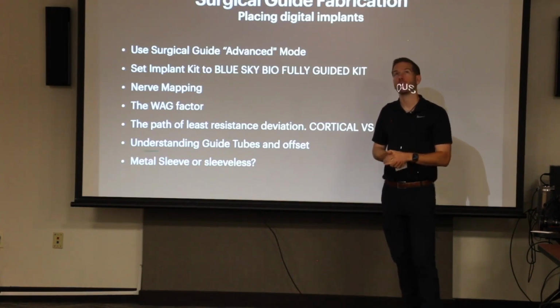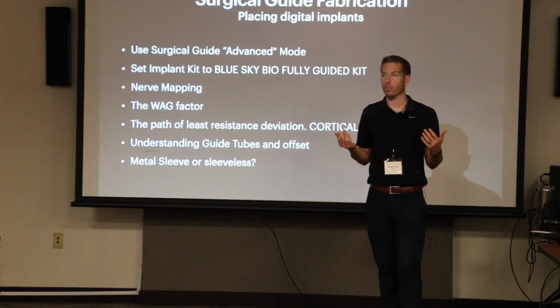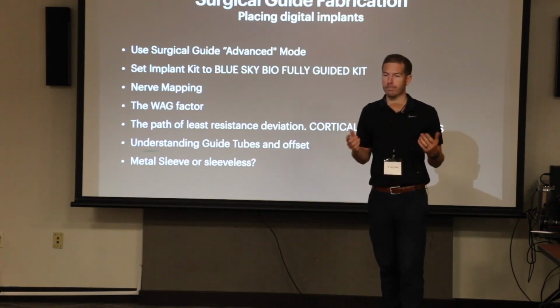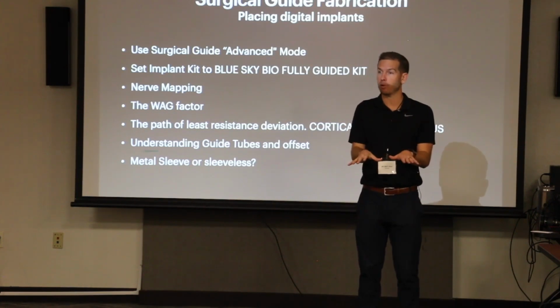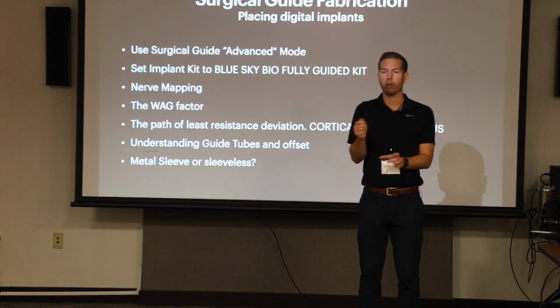On that note, when we calibrate and figure out what's comfortable for us, for the first couple of guides that you print, what I suggest is making 3 guides: one as the default, one 1/10 of a millimeter bigger, and one 1/10 of a millimeter smaller, and labeling them. In your first couple surgeries, another guide is 50 cents of resin. You bring those 3 to the table, and then you as the surgeon or your partner can try all 3 of those on and run through those.